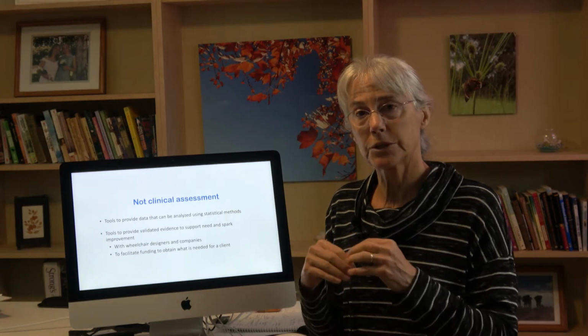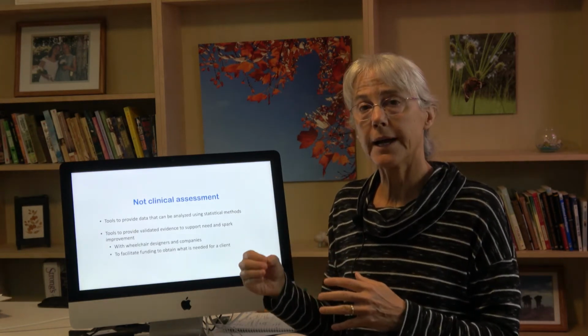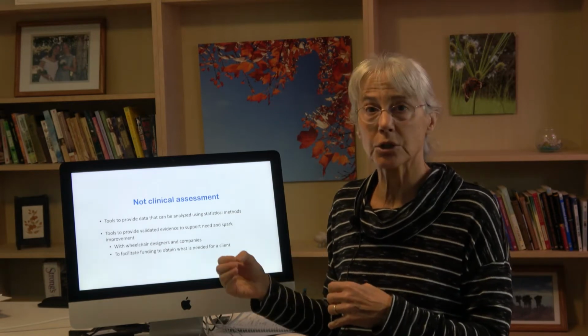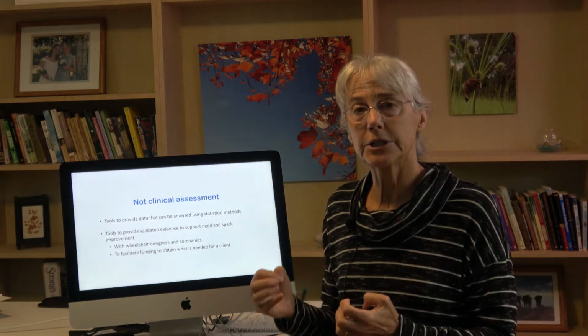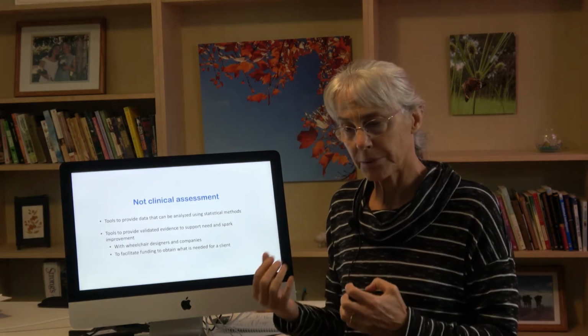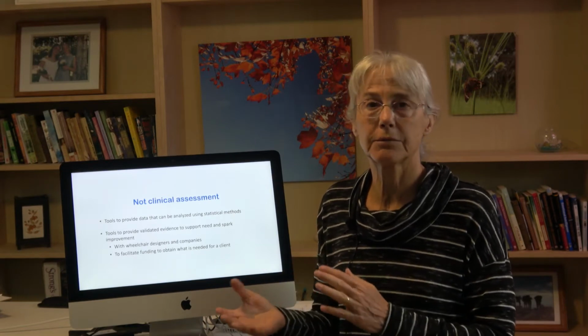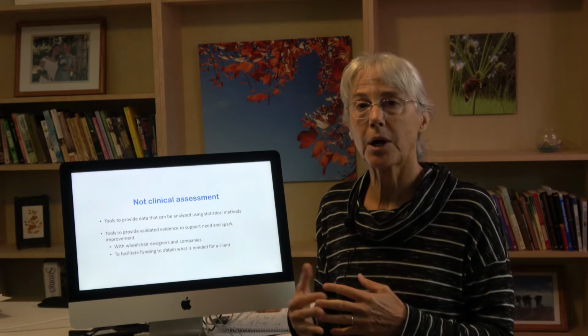And the needed changes are at two scales. One with wheelchair companies, which is what we were doing, to modify the design or confirm that the design is good. And the other is to facilitate funding for necessary changes, clinical changes for a wheelchair user. For example, does this wheelchair user need a different type of wheelchair for adequate mobility or for adequate postural support?